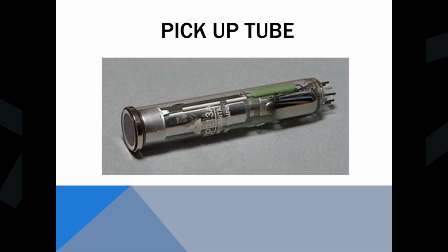So here's a pickup tube. Last pickup tube system I worked on was a few years ago. The radiologist was incessantly complaining about this old crap, why would they even have to use this stuff, and on and on. And I said, Doc, I understand these things are old. They were made back in the last century, and they were quite elderly and had their maintenance issues, but they really made a nice image compared to the early digital.